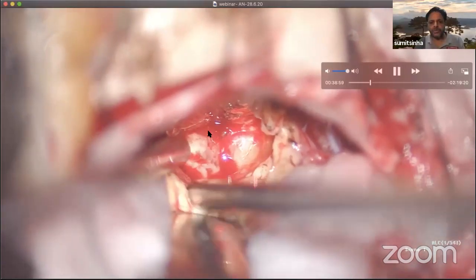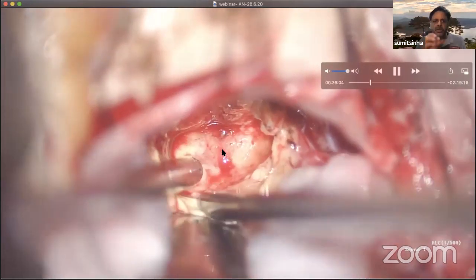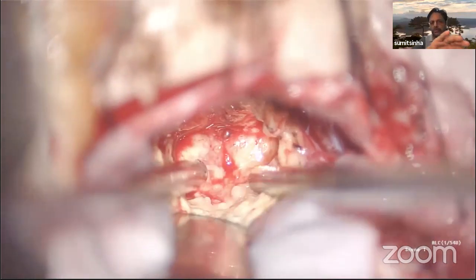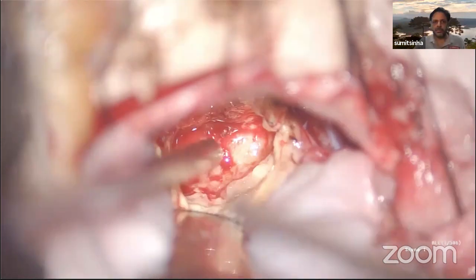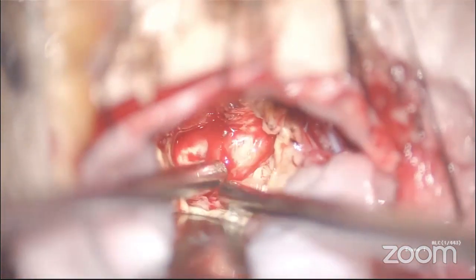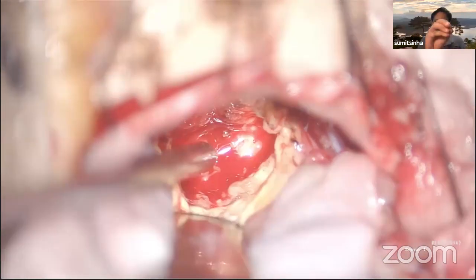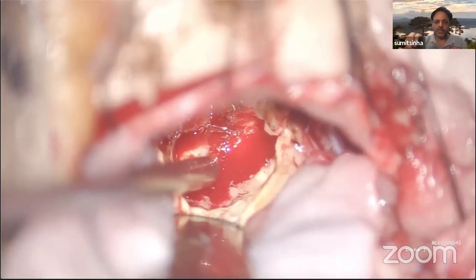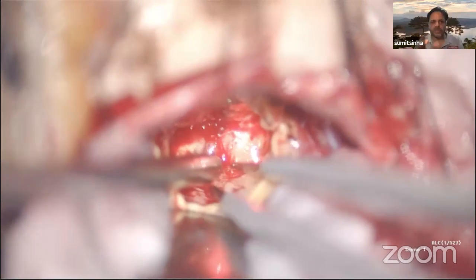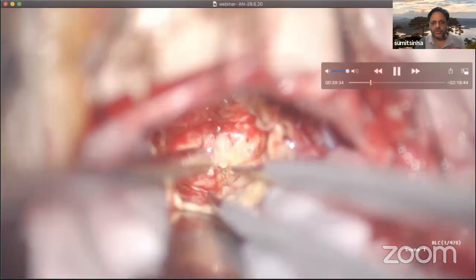So what I personally do is I take gel foam pieces and pack them inside the cavity and keep them for some time, and there the bleeding point is stopped, and then I move my focus from that point over to another point. So I keep on moving within the tumor in case of vascular tumors. The point which is bleeding, I pack it with the gel foam, go on to start working at some other area, and then come back to the previously bleeding area when the bleeding is stopped. So this is how I modify my approach in cases of vascular tumors.